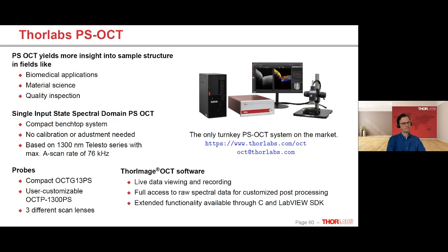And then it's fully polarized. So the OCT bases on interference, and the non-polarized light cannot build interference, so it's out. So the signals that we have are actually those that build the interference.